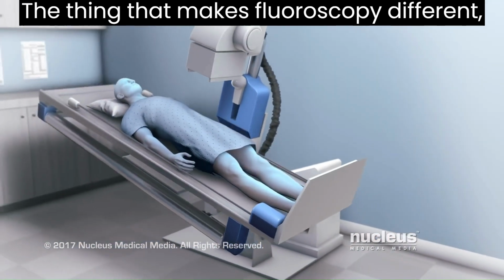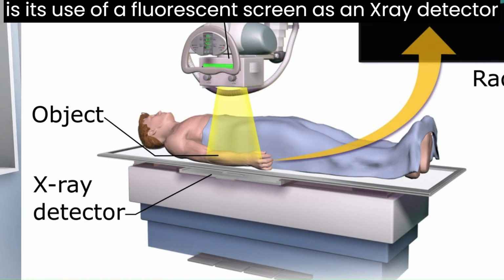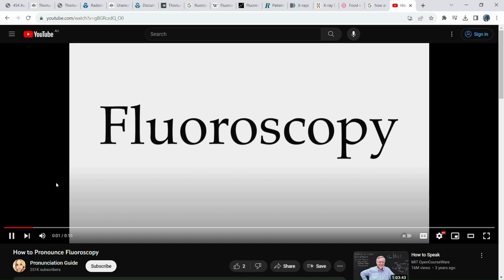The thing that makes fluoroscopy different is its use of a fluorescent screen as an X-ray detector to provide live images instead of having to wait several minutes for the image to develop. Hence the name fluoroscopy.